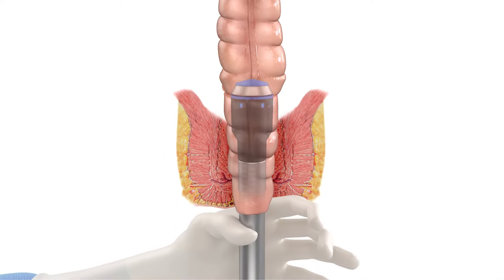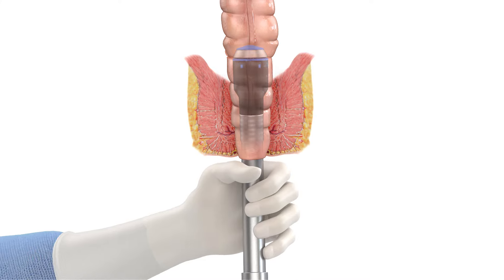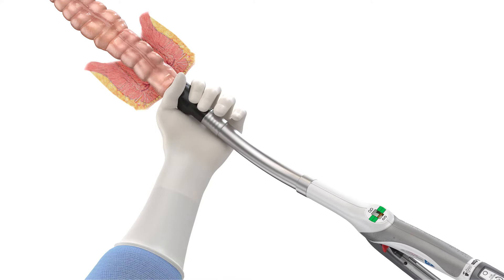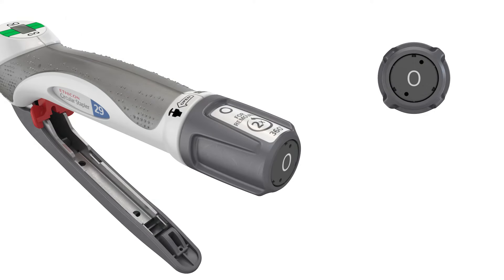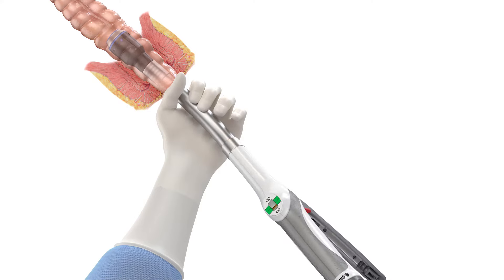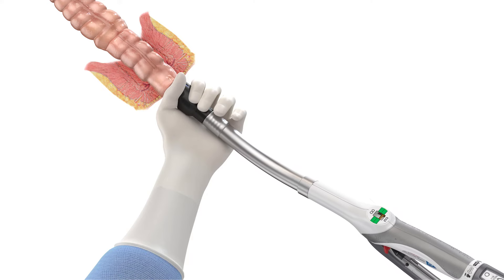Ensure the tissue has been released by rotating the head of the device 90 degrees in both directions, taking care to stabilize the head of the device to minimize movement of the distal tip. Remove the device by gently pulling it out while simultaneously rotating. If the device does not freely release from the anastomosis or does not withdraw easily, turn the adjusting knob counterclockwise one additional complete revolution — 360 degrees — then attempt removal again by rotating the device 90 degrees in both directions and gently pulling out while simultaneously rotating.